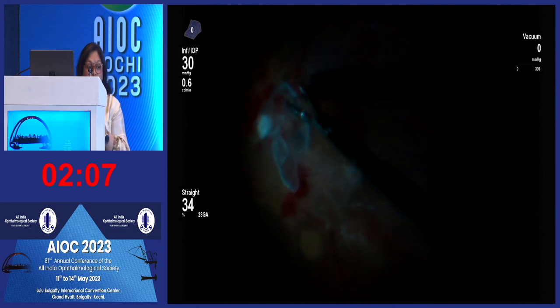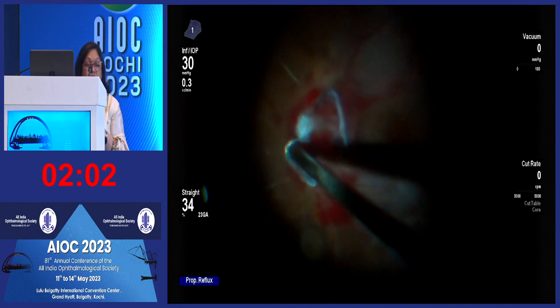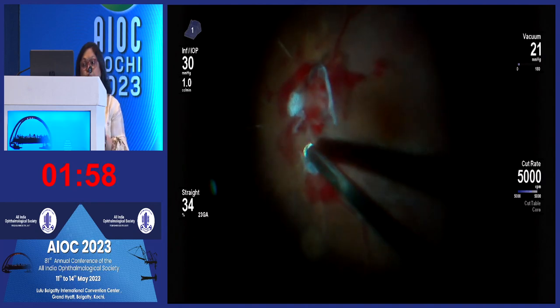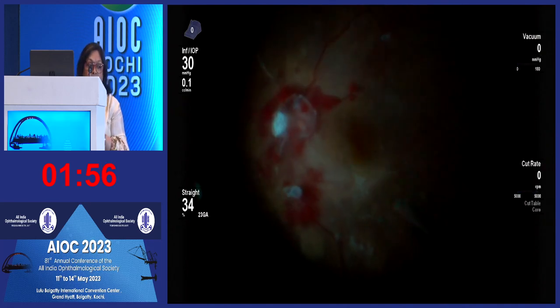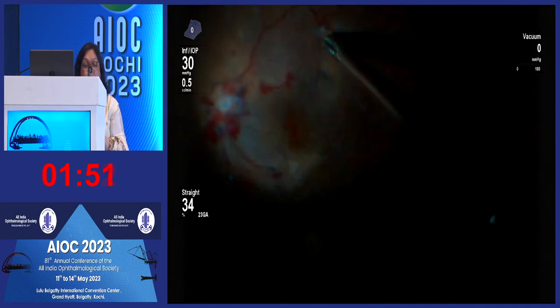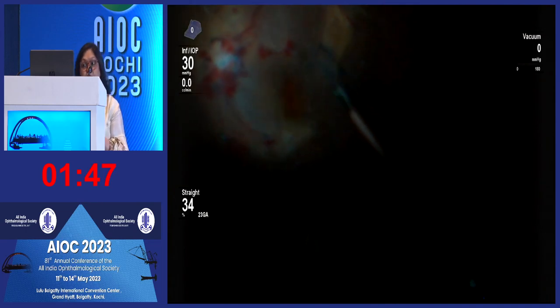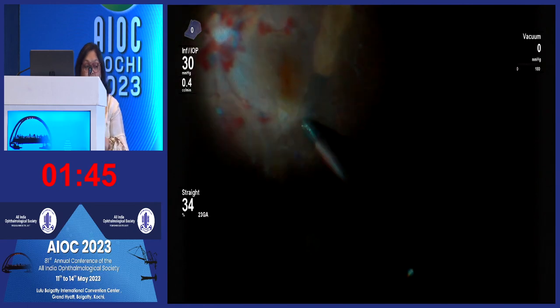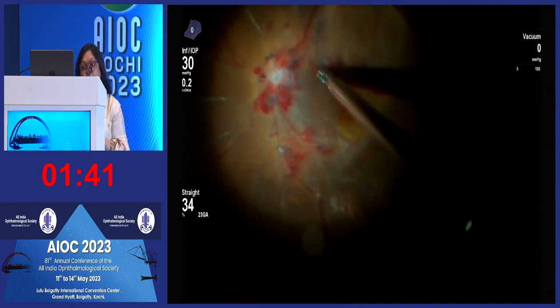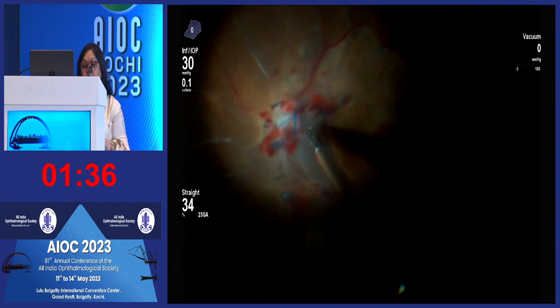Important point is to slowly pick up this fibrous prolif, and instead of going from the disc outside, the reverse is taken into consideration. We are going from outside inwards so that you prevent more traction in the retina at every point. And then the remaining ILM is again stained, and then the ILM is peeled off. You have to be very careful in such cases, because in a lot of diabetics, you'll have completely sclerosed vessels that you can see on the retina with a very thin atrophic retina, and you do not want to de-roof the macula at all in such cases.